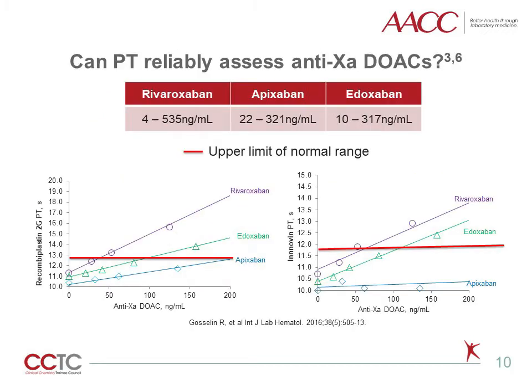This table represents the on-therapy range for each anti-Xa DOAC. The figures demonstrate the response of the two commonly used PT reagents in the U.S. — Recombiplastin 2G and Innovin — to various concentrations of DOAC-enriched normal plasma. The red line represents the upper limit of normal for the reagent instrument platform used. Note the drug concentration for each DOAC that intercepts the upper limit of normal. These data suggest the unreliability of the PT to adequately rule out drug presence or to estimate levels.